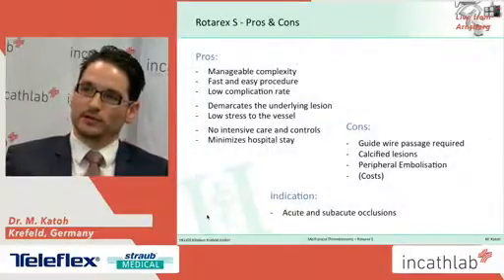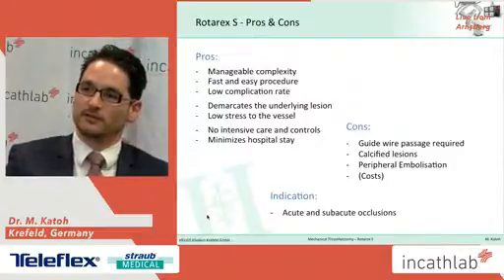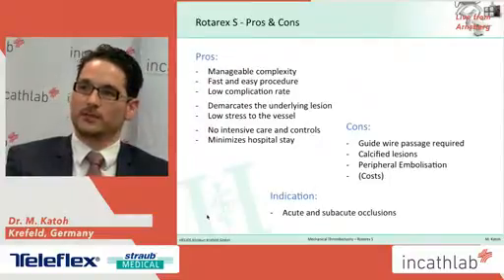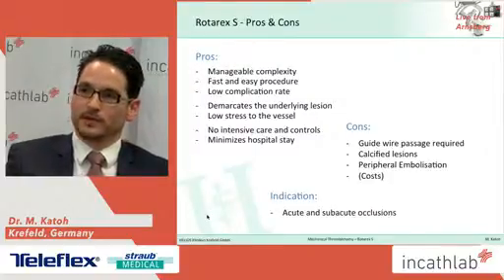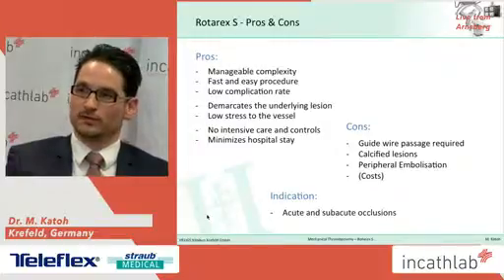So in conclusion, the Rotarex debulking device is a quite straightforward debulking device of manageable complexity. It is easy to learn, it's a very fast procedure, and is associated with very low complication rates.